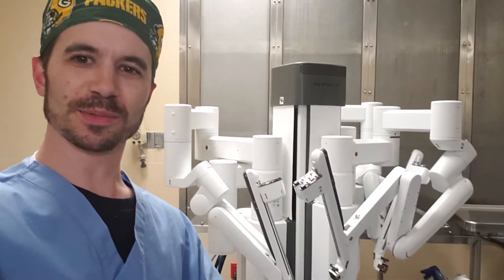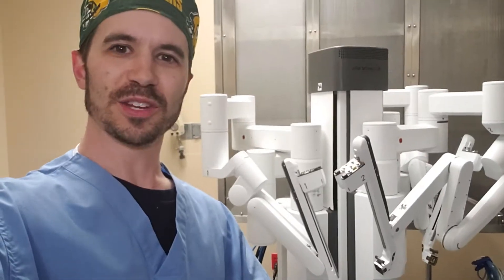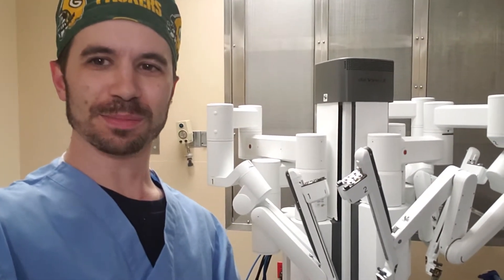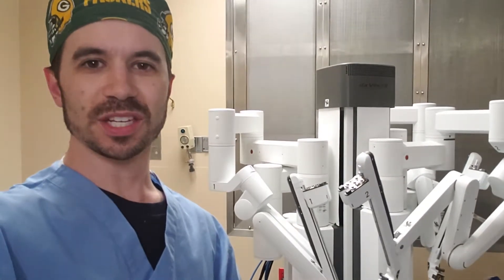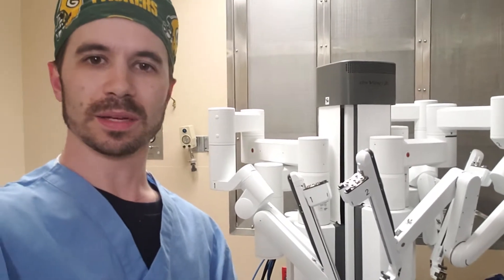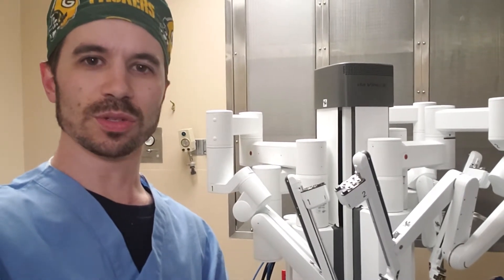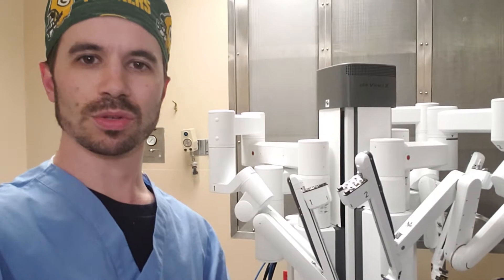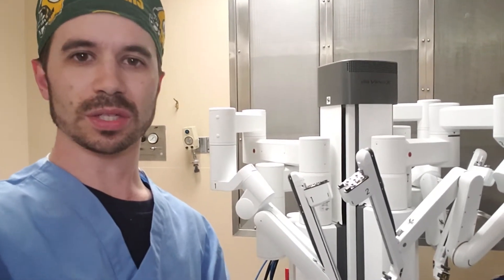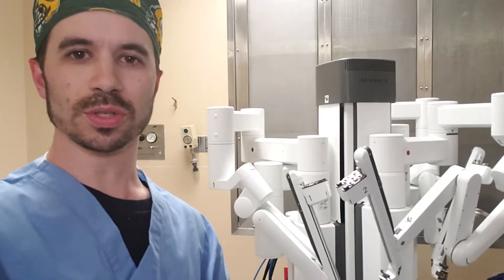I'm standing here with the robot with the arms folded up. You might be wondering what a stapler is and why we would use it in surgery. It's not the same kind of stapler that you would use for office supplies to hold papers together. What we use helps attach tissues together and then make a new connection. So if you have the stomach being attached to a piece of intestine, you can use that for a gastric bypass, or if you're removing a piece of the colon or other small bowel and reattaching it to another piece of intestine, you would use a stapler.